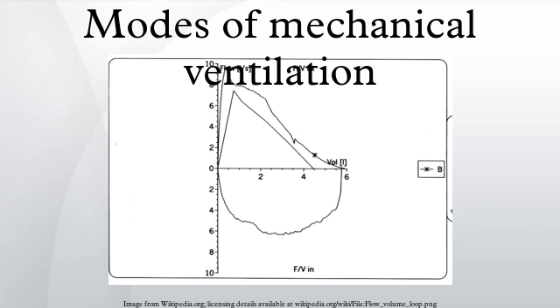Volume-controlled. Volume-controlled systems of ventilation are based on a measured volume variable that is set by the clinician. When the ventilator detects the set volume having been applied, the ventilator cycles to exhalation. This is measured various ways by each brand and model. Some ventilators measure using a flow sensor at the circuit Y, while some measure where the expiratory circuit plugs into the expiratory port on the ventilator body, which means that the machine will give all support to take breath to the patient.